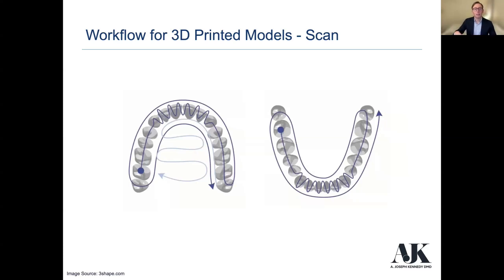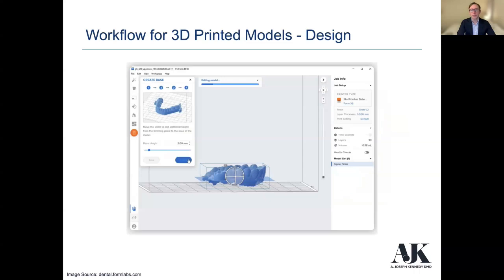So what I'm saying is it's really important to know the type of scanner that you have. There are very specific techniques, so I implore you to take a look at the manufacturer's instructions on how to do the scanning, because it really does impact how the quality of your digital scan ends up being, which is the basis and foundation for the print ultimately.